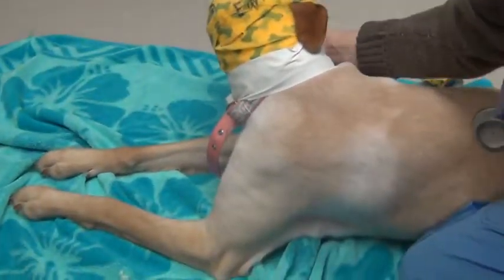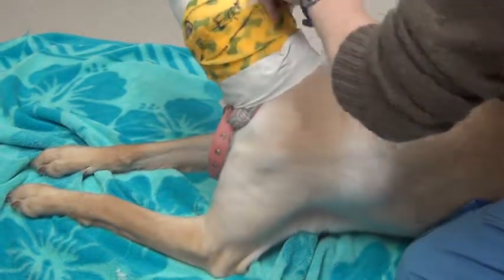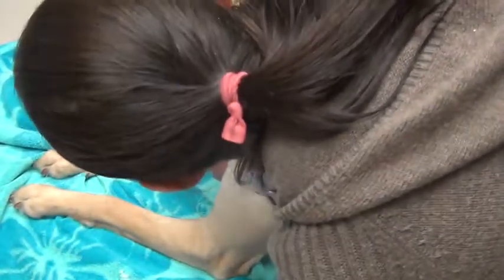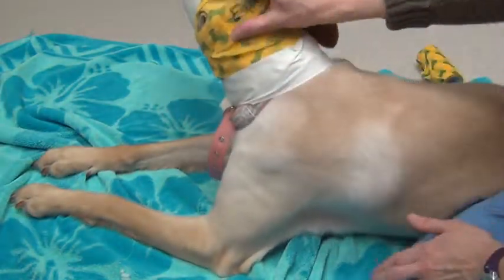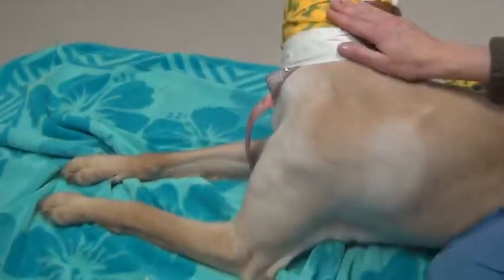Just yet. Come here, Stacy. So we've got the other ear out. Make sure that we don't have it ill positioned. And we can see into our canal on the other ear, on the unhealthy hematoma ear. And we do have it wrapped, so people will be careful when they come in to take the bandage off.